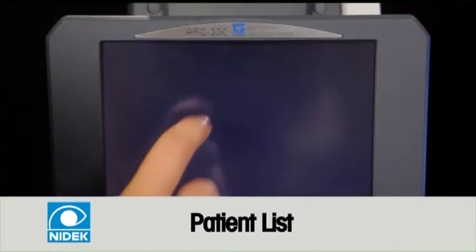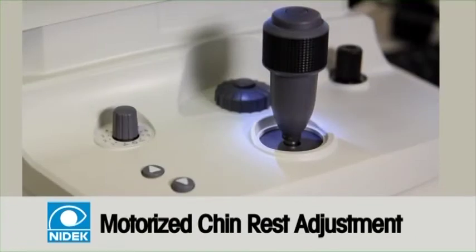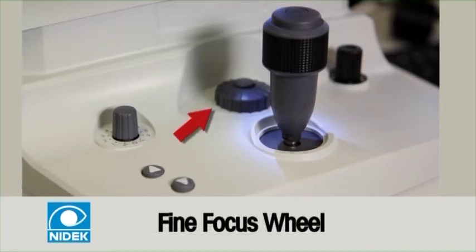The gray bar on the top of the screen is the patient list. By pressing on that, you will access the list of names or enter a new patient. On the joystick panel, on the bottom left, you will find the chin adjustments. The chin rest is motorized. Above that, you will find the infrared light adjustment. The infrared light adjustment is helpful when focusing on the patient's retina. To the right of that, you will find the fine focus wheel.